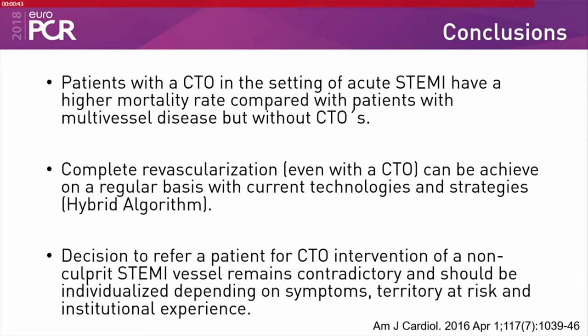And if you know that by SYNTAX 4, the right coronary, when dominant, is nourishing 16% of the left ventricle, and you already have collaterals, I doubt that it will prolong the life of this patient. So further testing to prove the amount of ischemia and the symptoms is necessary. No straight dilatation. And third day is the worst day to repeat the contrast exposure regarding kidney susceptibility.